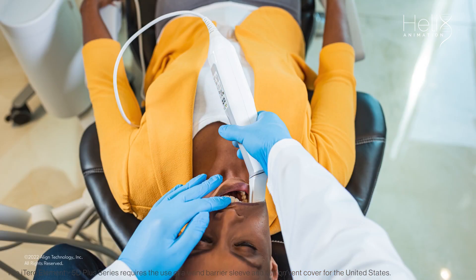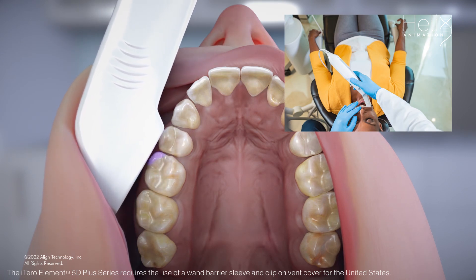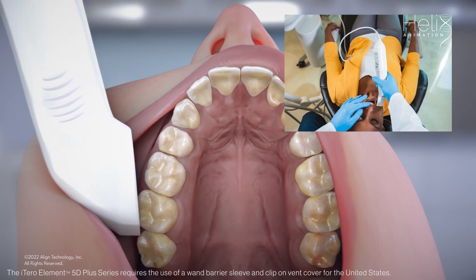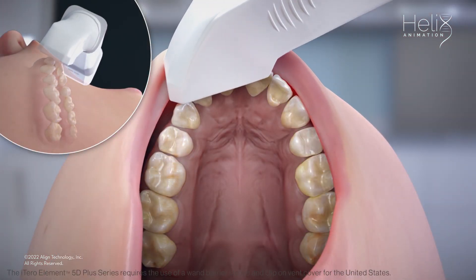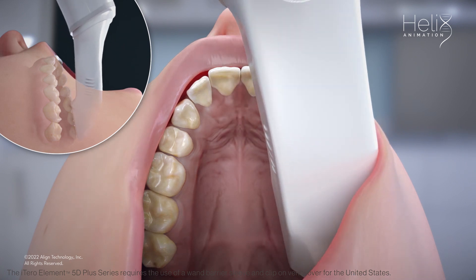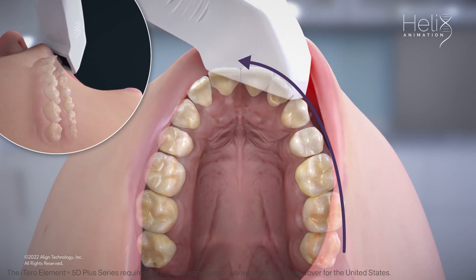Next, scan the buccal while holding the wand in a horizontal position. Use a rocking motion as you move towards the anterior to capture the interproximal anatomy of the buccal. Bringing the cable towards the arch will capture the mesial interproximal anatomy, and taking the cable end away from the arch will capture the distal interproximal anatomy. Keep the wand in contact with the teeth in the same way that the bristles of a toothbrush are in contact with the teeth when brushing. When you cross the midline, remove the wand and then place the tip on the opposite terminal tooth. Use the same rocking motion to capture the buccal surface from the posterior to the anterior. Moving from posterior to anterior on the buccal reduces the interference from the cheek and provides a smoother scanning experience for you and the patient.